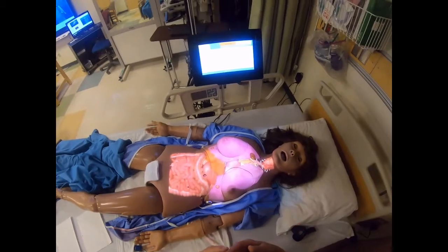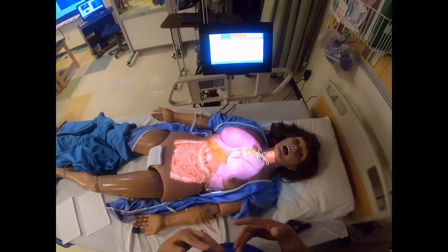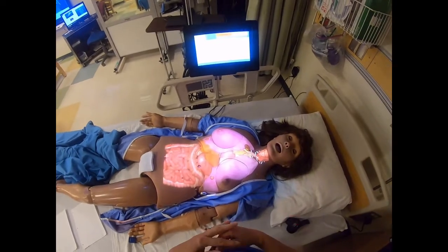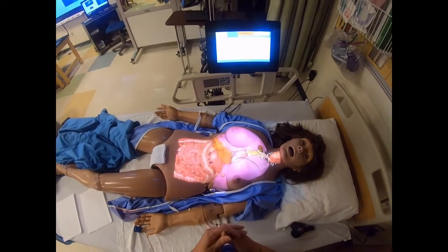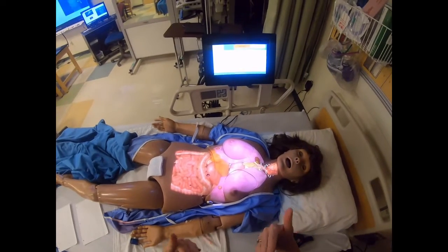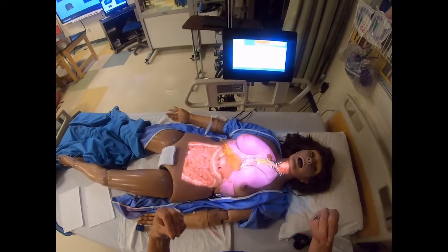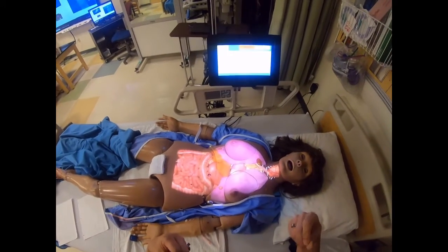So we can see false readings there as well. If we have a patient who has been exposed to smoke, we will do another test called the carboxyhemoglobin, and that tells us more in detail what the hemoglobin is saturated with.